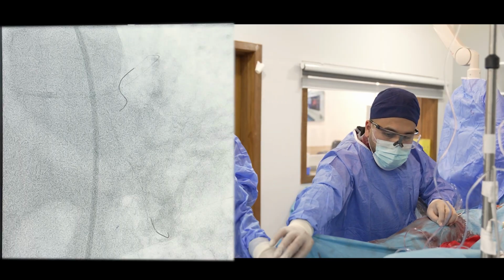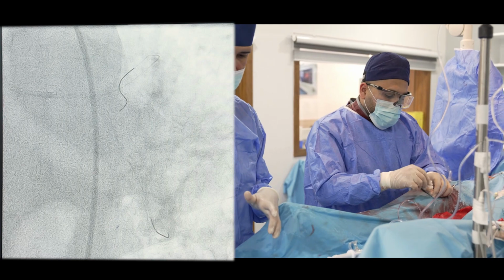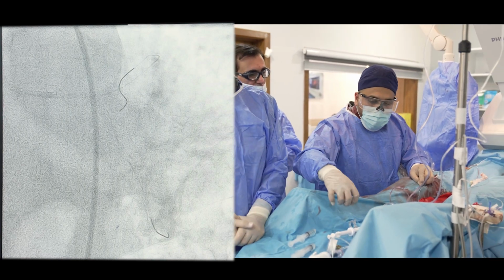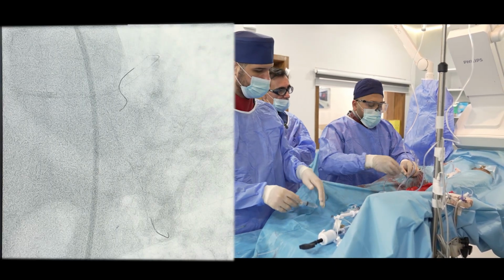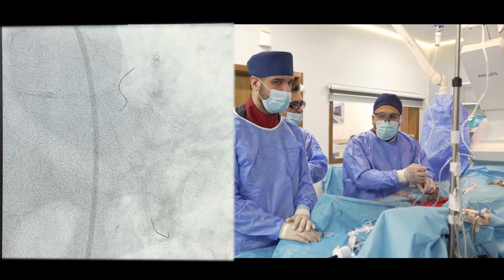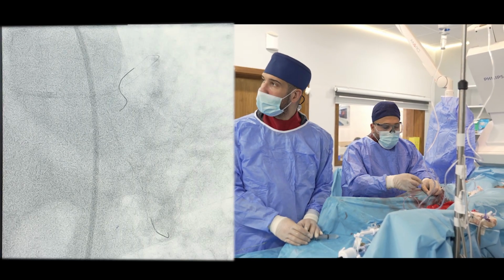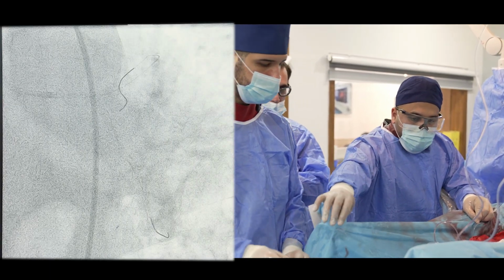And then we take 2.5. Maybe we do POT, side POT. We didn't do the first POT. We are going to do inflation at the ostium of the circ by balloon 2. Where is it? Balloon 2 millimeter. 220. 215. It's okay.